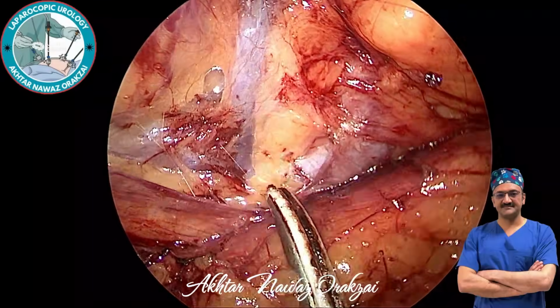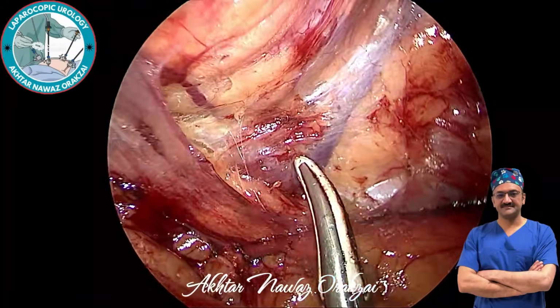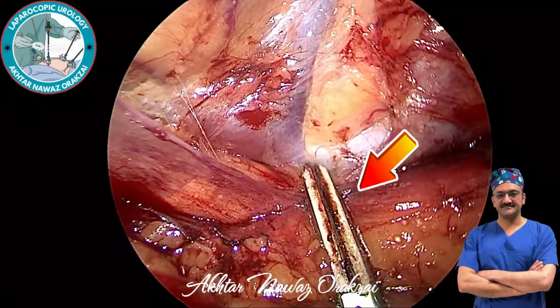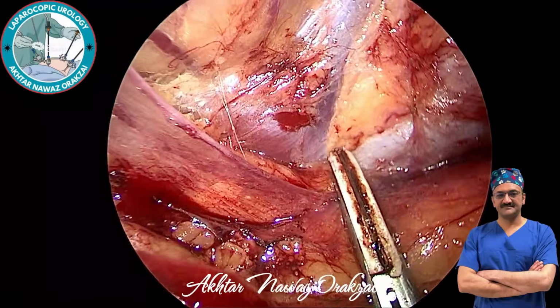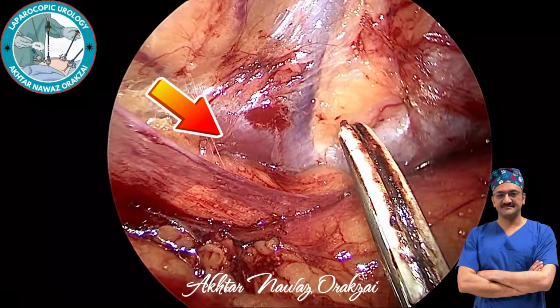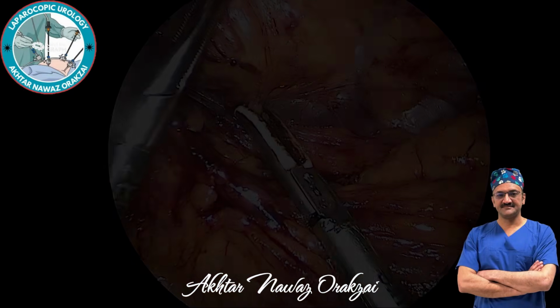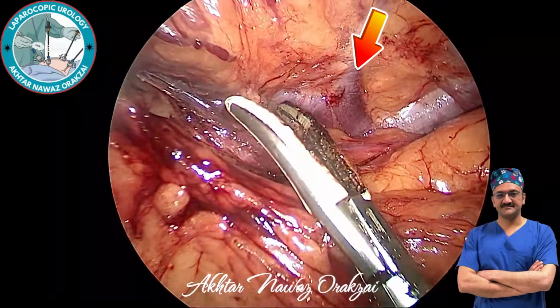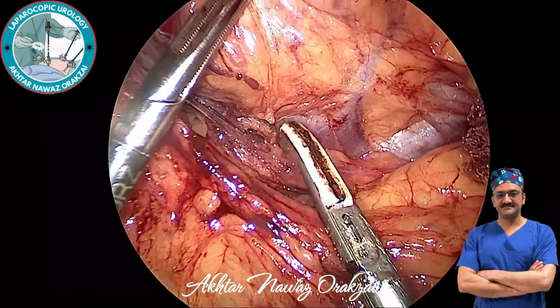Here there is a little bit of change in the anatomy. You can see that there is a bigger vein of the kidney, renal vein, which is draining two veins. One is adrenal vein, which is going horizontally towards the adrenal gland, but the other one is a vertical vein which does not seem to be draining the adrenal vein.